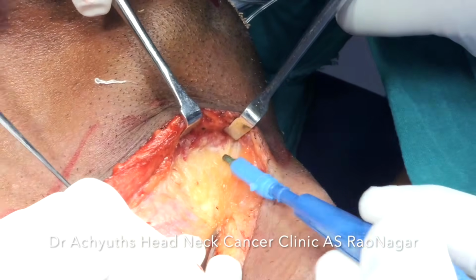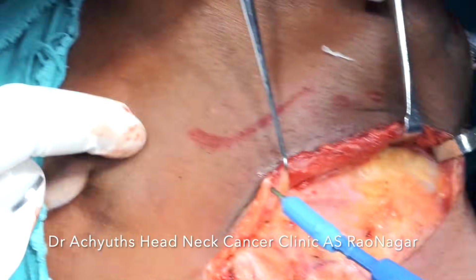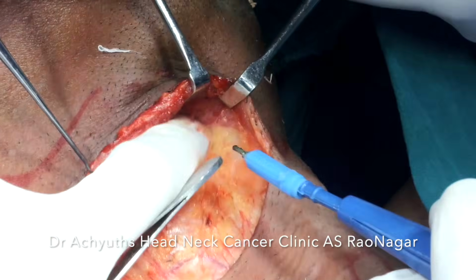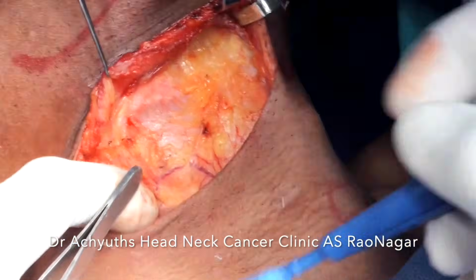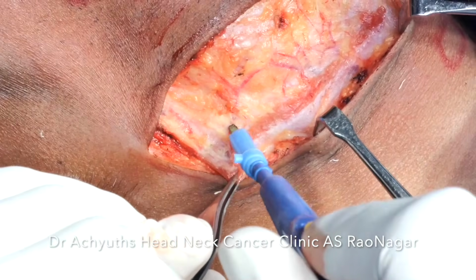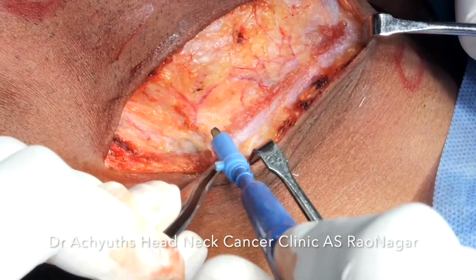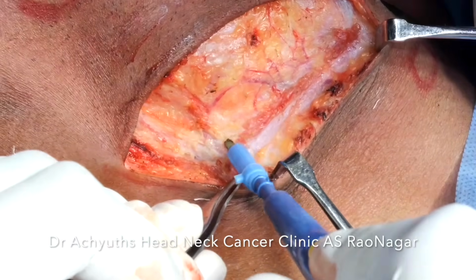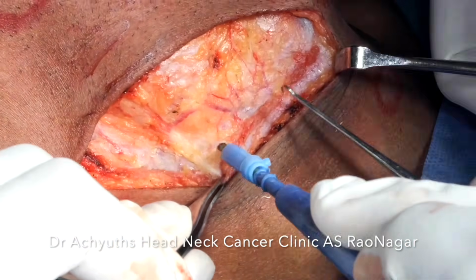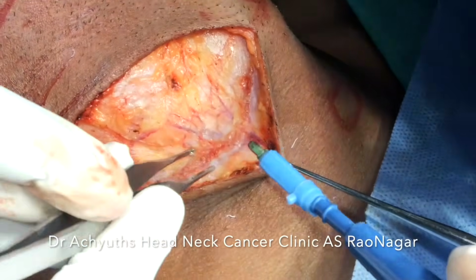and anteriorly we have to divide the fascia and expose the hyoid bone, because during the dissection and during the excision of the cyst we will have to denude some part of the hyoid bone. As we do a superior part, we are doing the inferior part as well. So the pink line which we are seeing is the platysma, and we do a subplatysmal dissection.